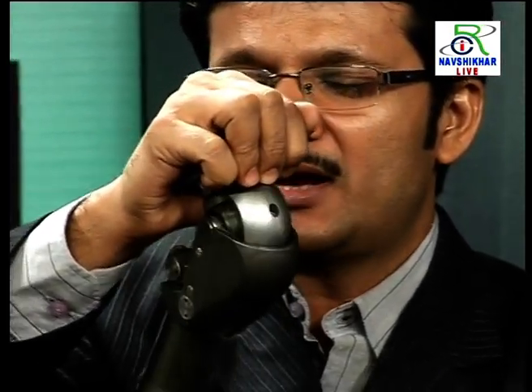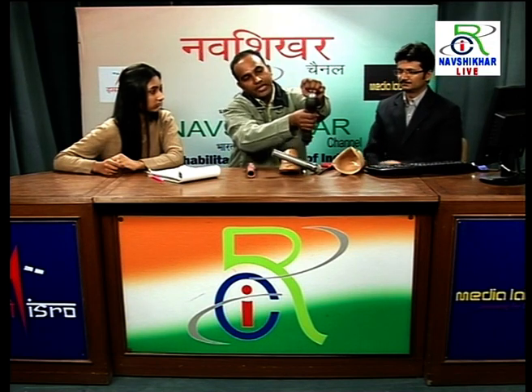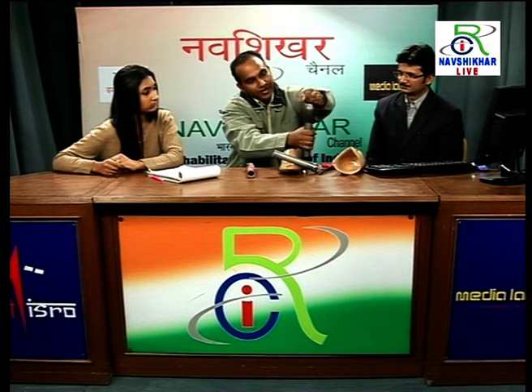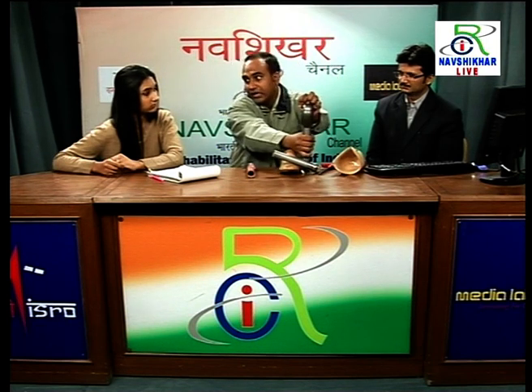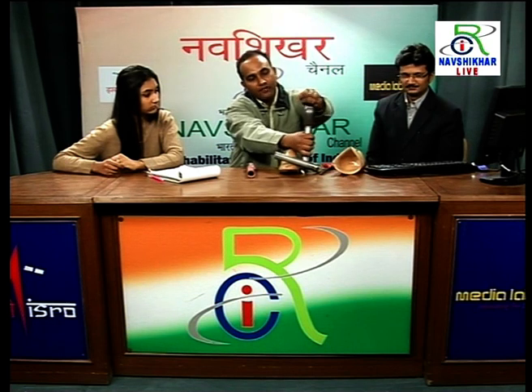So to activate such knee joints, the patient has to advance one limb, then a flexion moment is there, energy is stored, and that is released during toe-off. These are designed and aligned in such a way that when the patient heel strikes, it automatically gives way, and when the patient is fully loading in standing position, it will not move. So there is security also. Whenever he does the heel strike, it automatically rotates because of weight. These are basically weight-actuated knee joints.